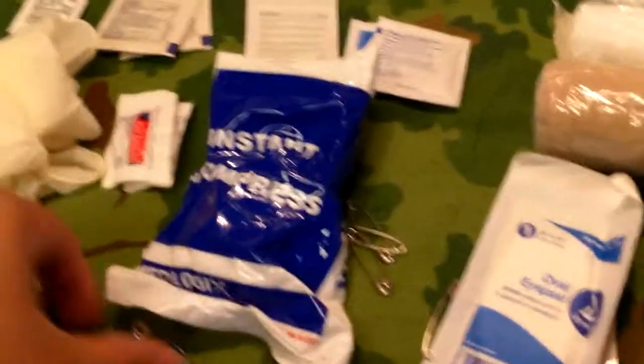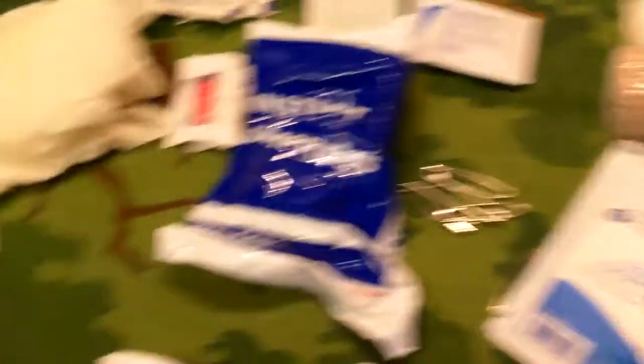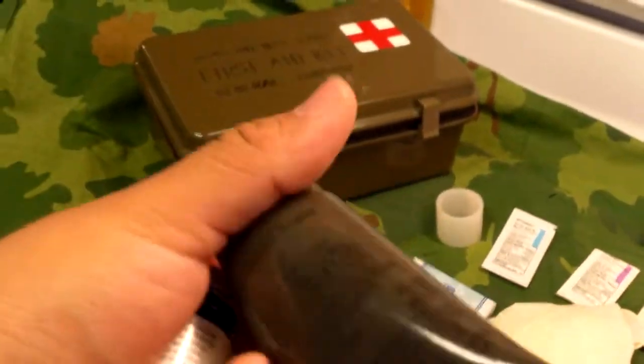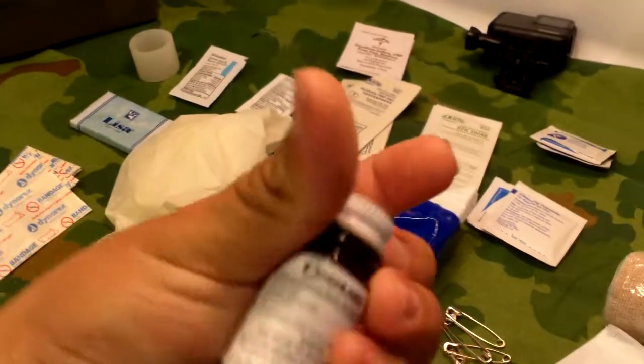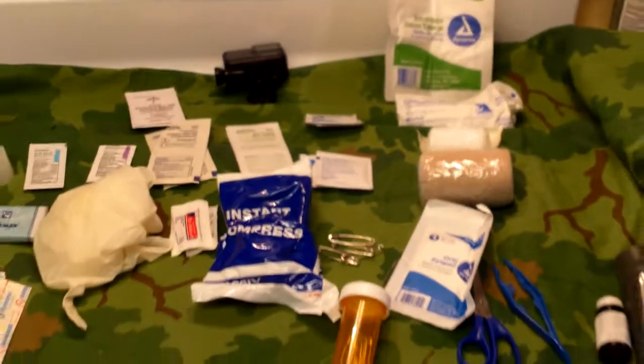One eye pad. Six safety pins — looks like you've got five in here and five out here, so some of these are not original to the kit. And one pill bottle. The only two things I added were this USGI insect repellent cream and water purification tablets — everything else is original to the kit.